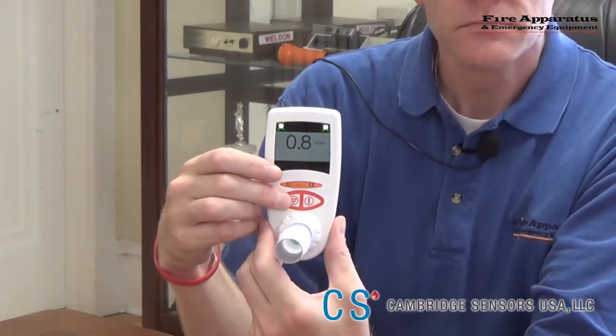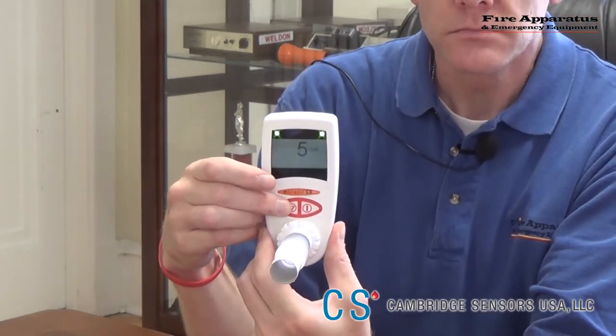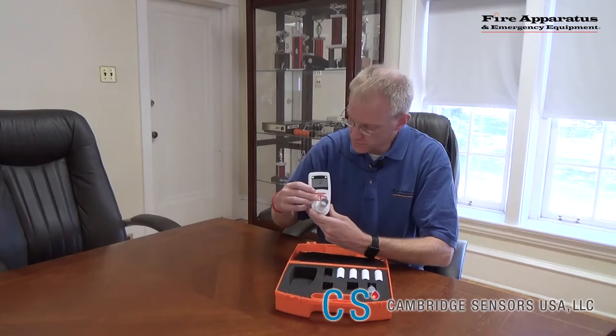Once the test is done, simply turn off the analyzer with the right button after viewing your results.